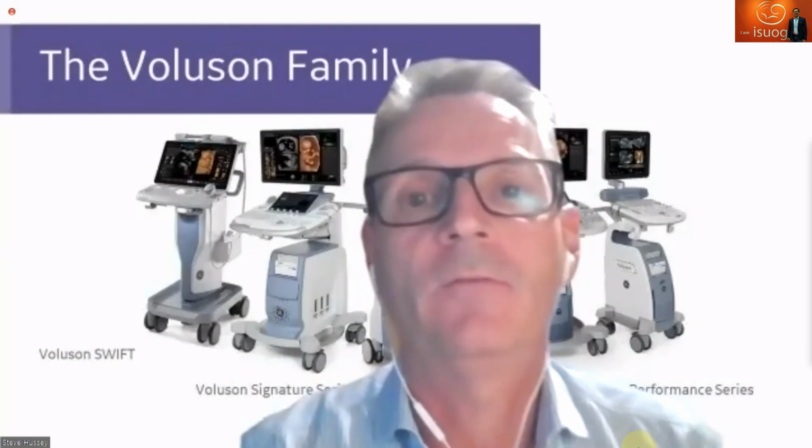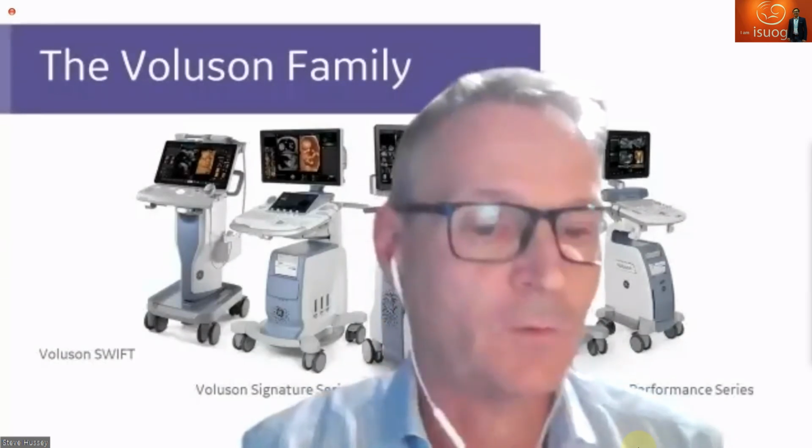Excellent. Do you use any specific PRF for VSDs or AVSDs? That was another question in the chat box. Yeah, in general, when I suspect a VSD, I will reduce the level of the PRF in order to document if there is any filling, or crossing the septum. But in general, I'm not doing a lot on these things.